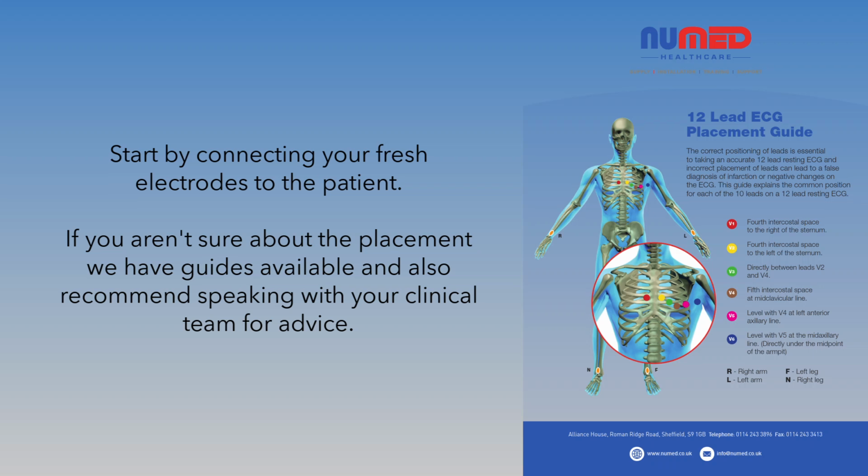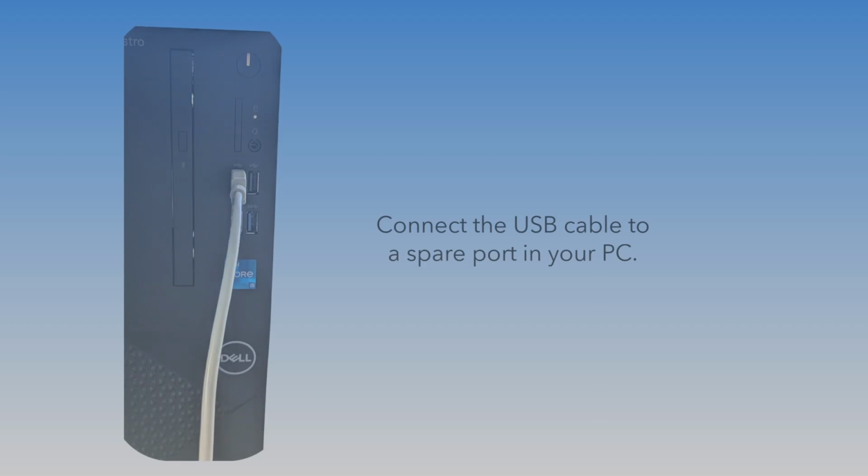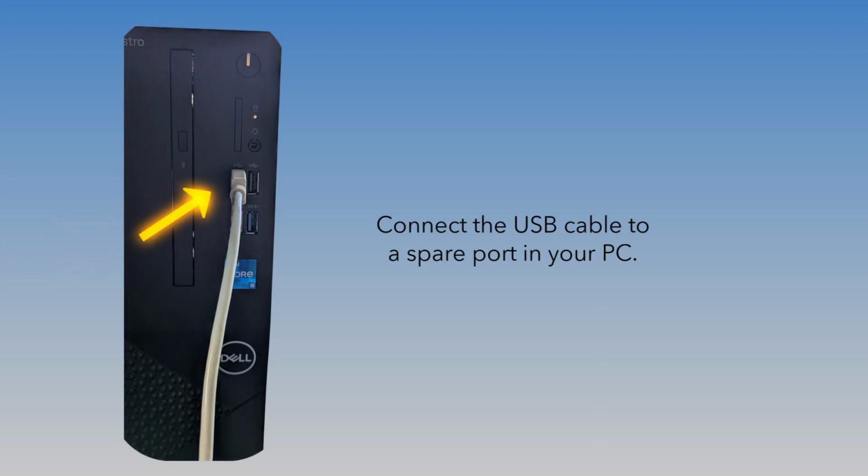Start by connecting your fresh electrodes to the patient. If you aren't sure about the placement, we have guides available and also recommend speaking with your clinical team for advice. Connect the USB cable to a spare port in your PC.